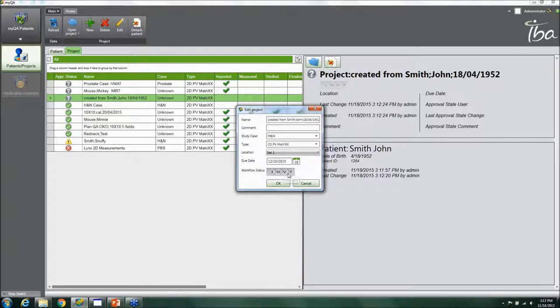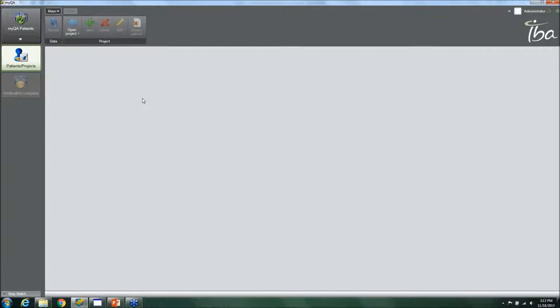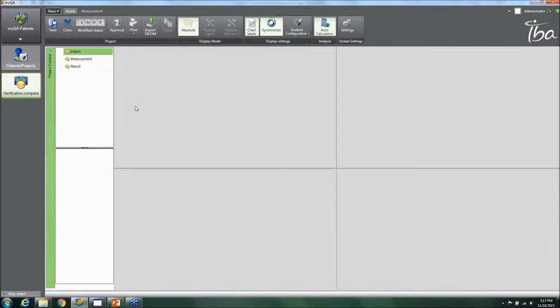After saving the patient, you can open up the project by double-clicking or clicking Open. This gives you a window showing three tabs: Import, Measurement, and Results.